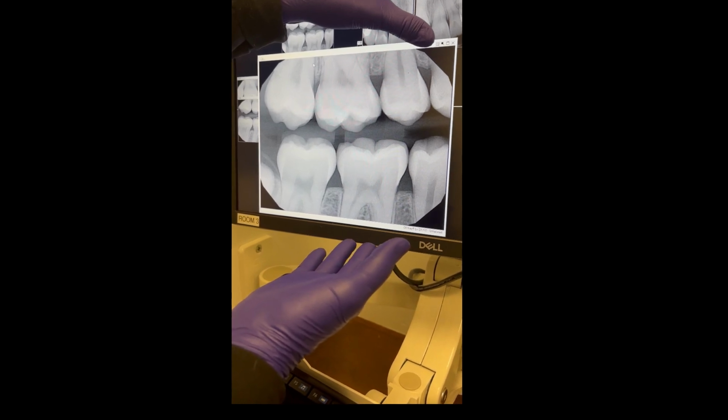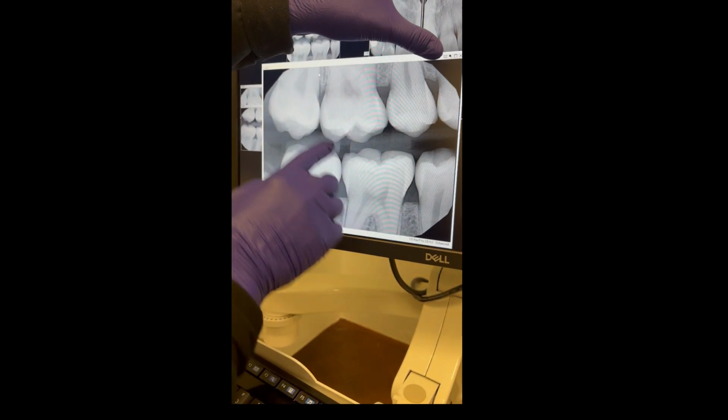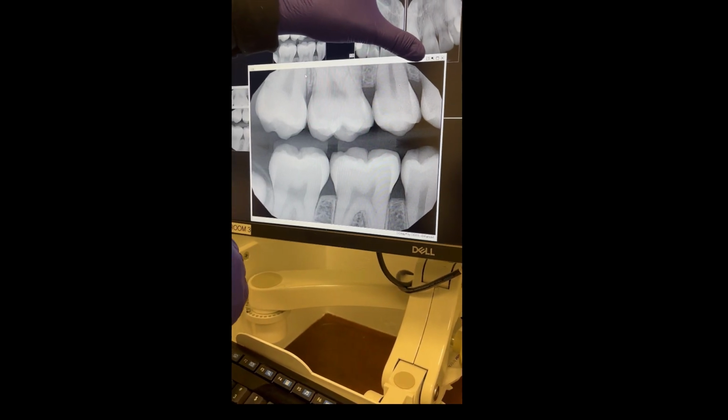Okay, here's the image that I've just taken. As you can see, I've opened up the contacts of the premolars and the molar, so we can see really nicely between the teeth. I can see the bone levels, which is another thing that we're trying to make sure we capture in the image.